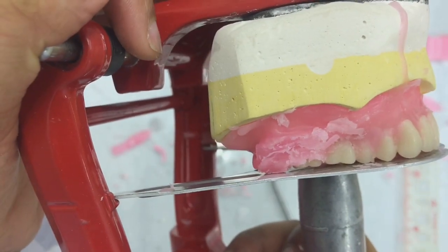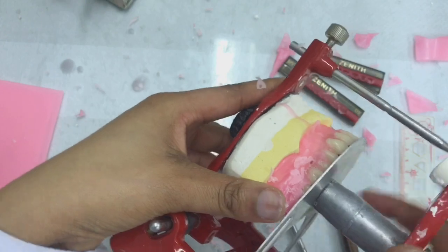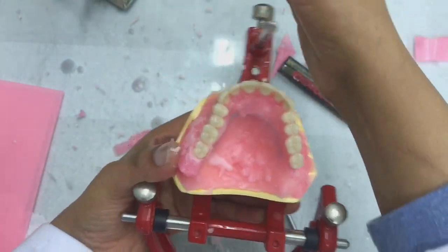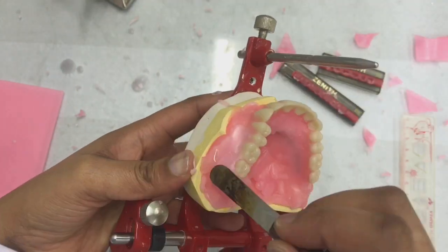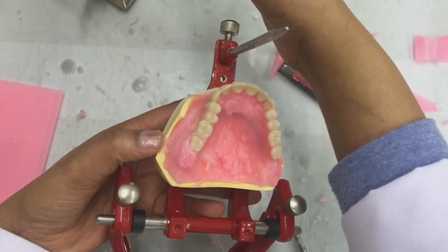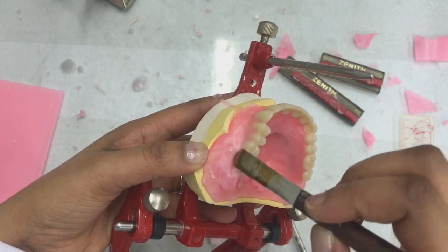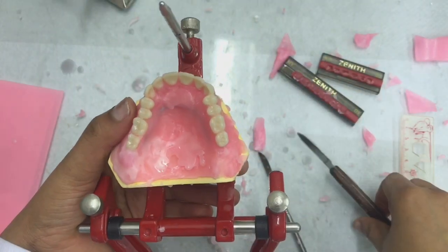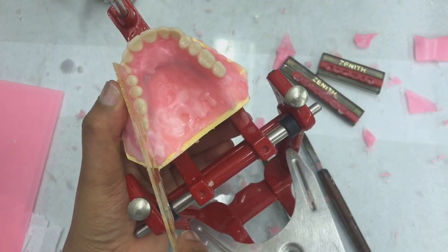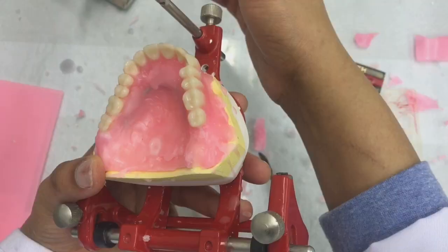Okay, that seems fine. Similar to this side. Okay, so I'm just going to remove that wax and I will be done. Ensure that my tooth is sealed. Okay, just a last double check of my positioning. Okay, great. Okay, so I'm happy.